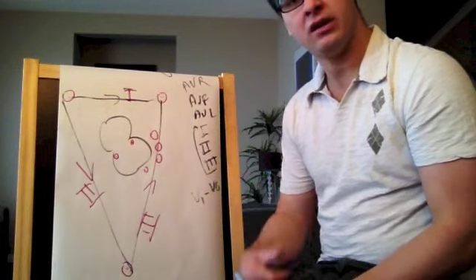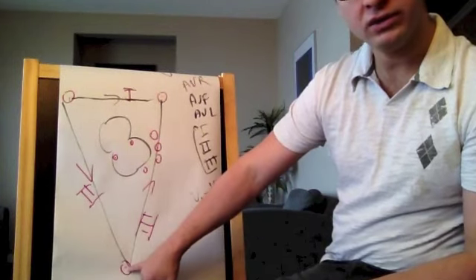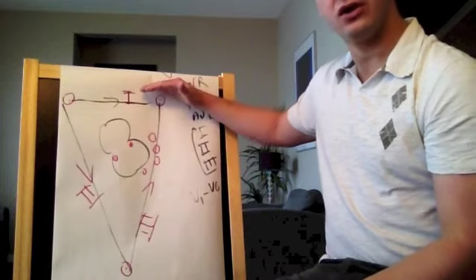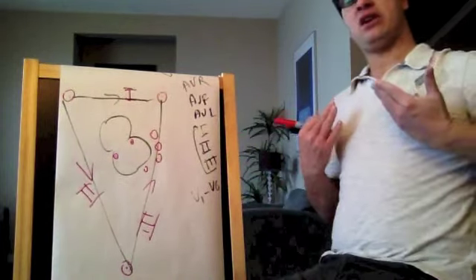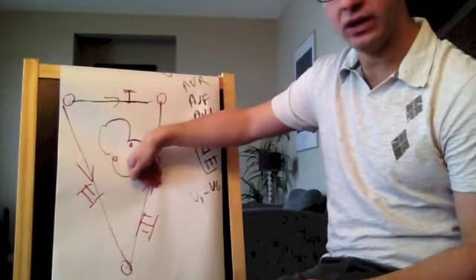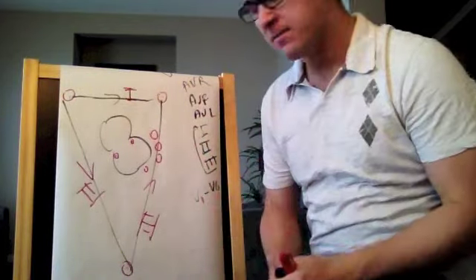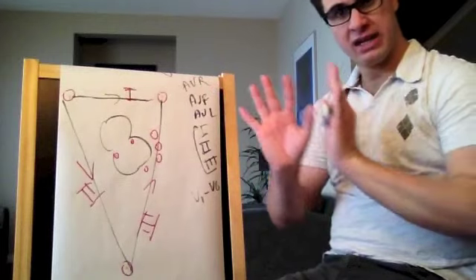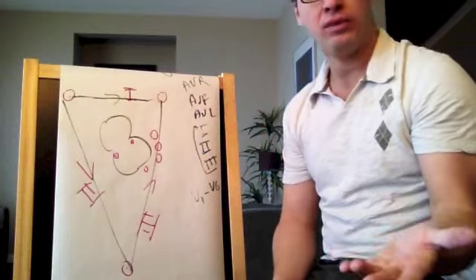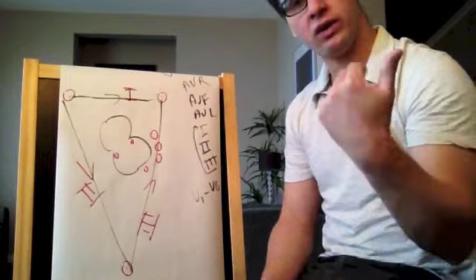If you look at lead 3, most of the stuff is negative. Why? Rule number 2. Rule number 2 is that electricity goes from there to there. So electricity seems to be going this way, but I'm reading it in a different way. As electricity is going away, not towards me, because I'm reading the electricity at a different angle, it will be mostly negative because the electricity is going away from me. So that's why in lead 3 mostly it's negative.